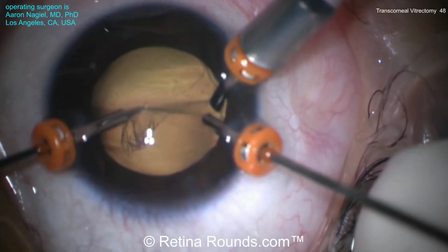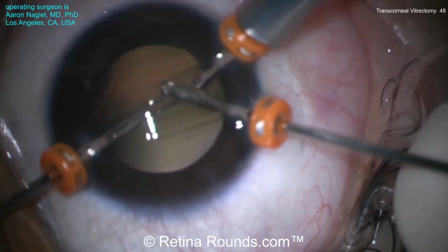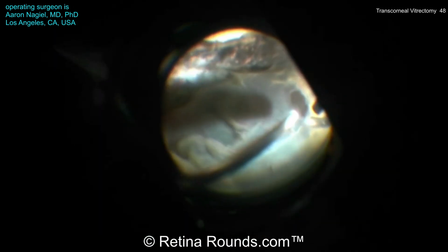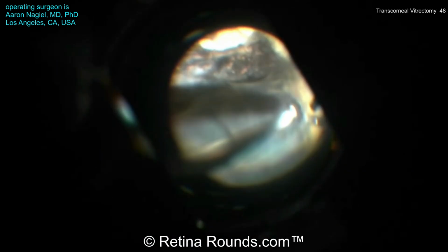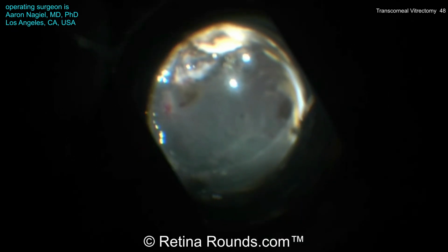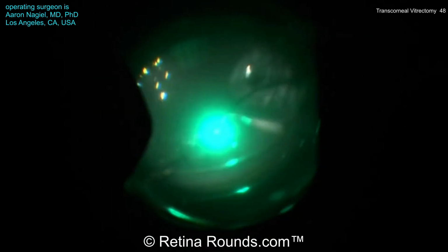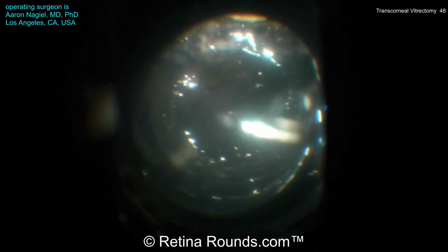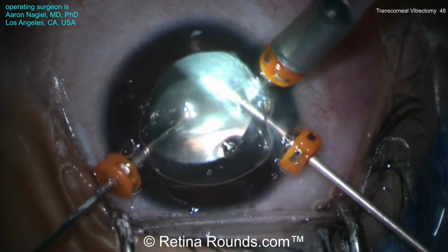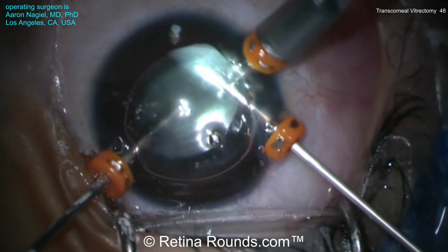The lens capsule is now being removed using a max grip forceps. And you can see here that inferiorly, proximal to the infratemporal arcade, there's the regressed retinoblastoma, and there's a break here that's located more temporally. Through that break, subretinal fluid is drained. Laser is applied around the retinal break, and 360 laser is also performed to provide some additional support. In this case, silicone oil is being implanted, and an inferior peripheral iridectomy is performed.